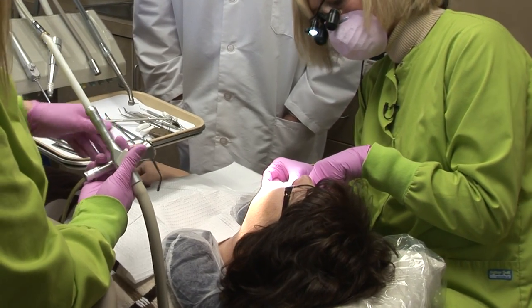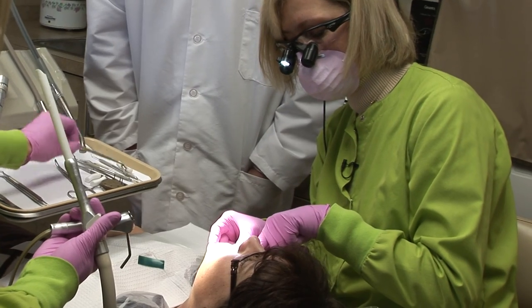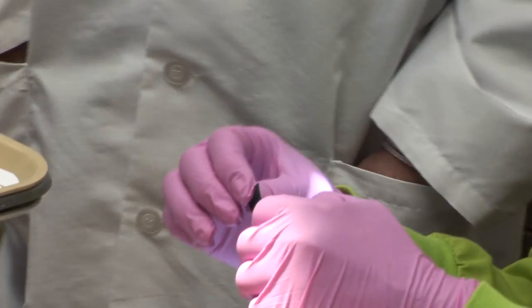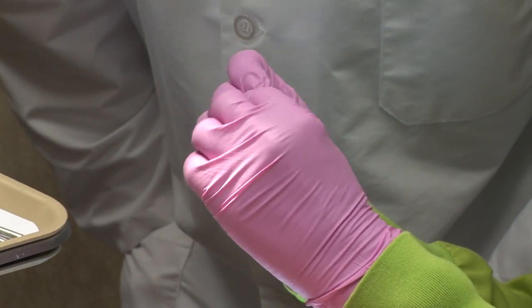Bite together. Turn away from me a little bit. Now I want to make sure I have enough clearance to put gold between there, and so I use this gauge. This is half a millimeter thick. If I fold it in threes, that's a millimeter and a half thickness.